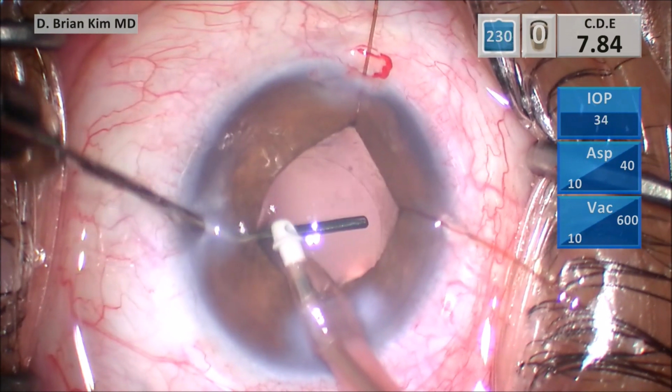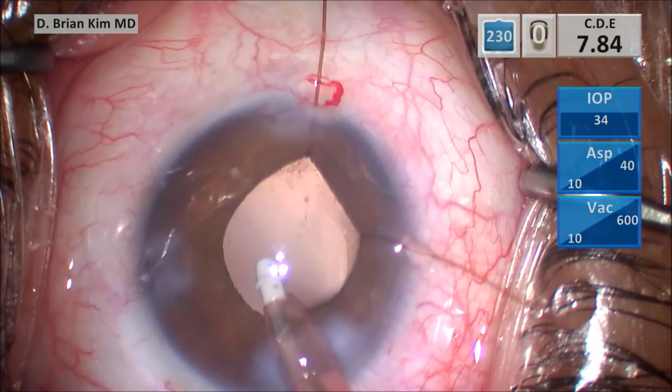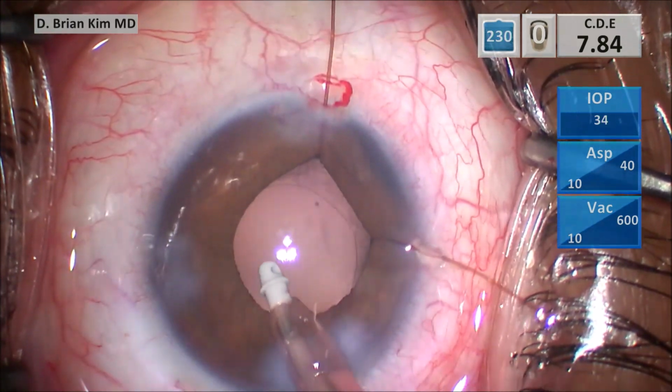I'm pulsing BSS into the subincisional area as well as the fornix in the area of the iridodialysis, and I feel like it's pretty clean.